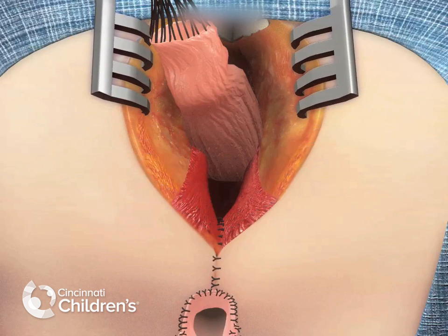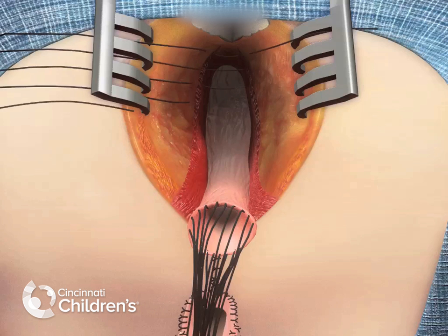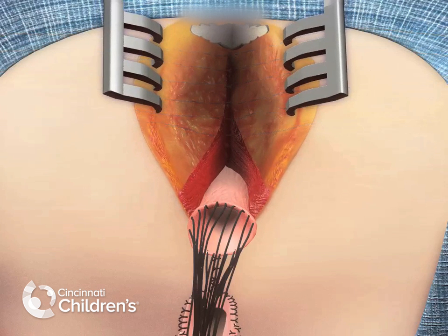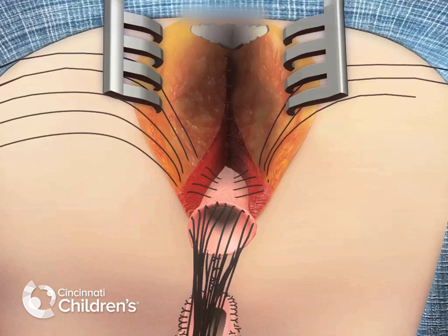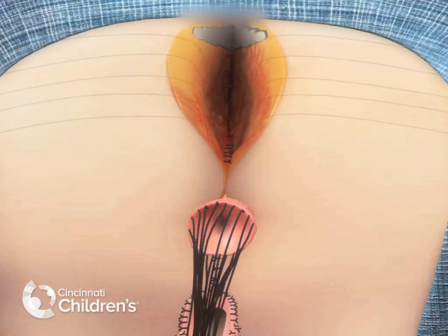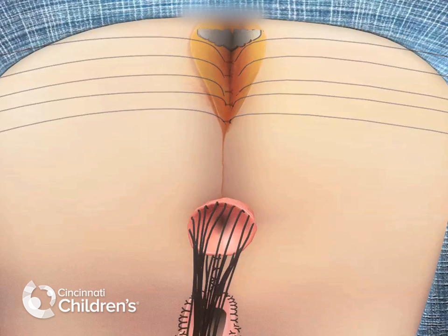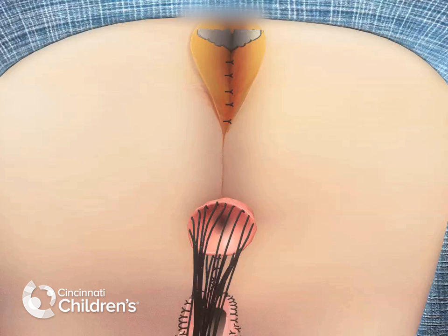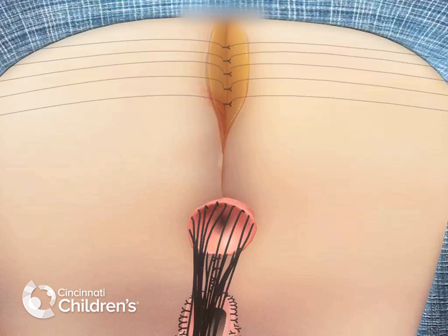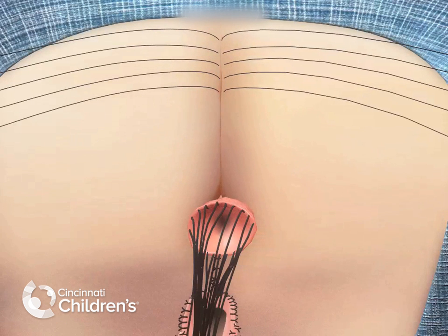Once the perineal body is closed, the rectum is positioned in the center of the sphincters, and the posterior aspect of the incision is closed in layers. And the rectum is tacked. Again, it is important to close this wound in layers to prevent creation of a large dead space. The skin is typically closed with long-term simple absorbable sutures.